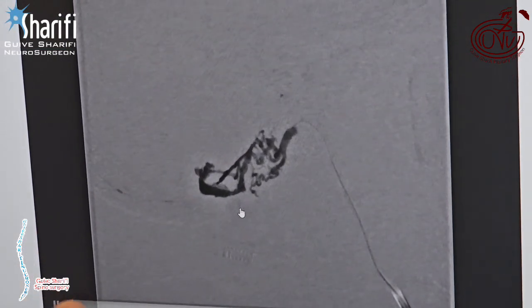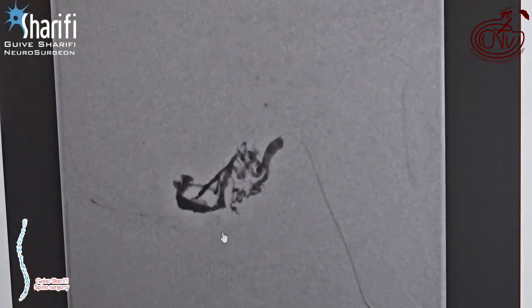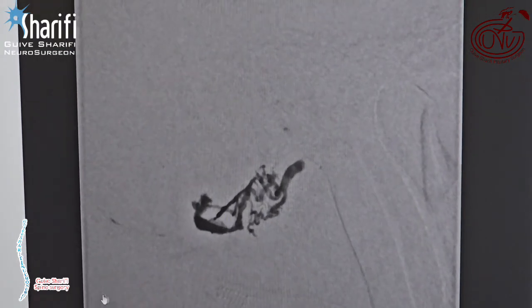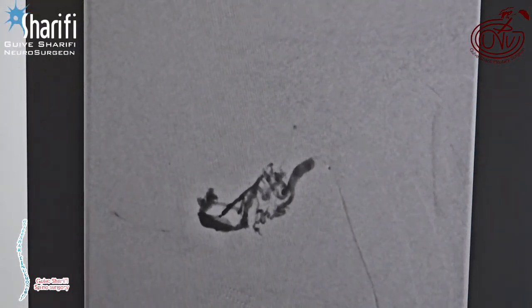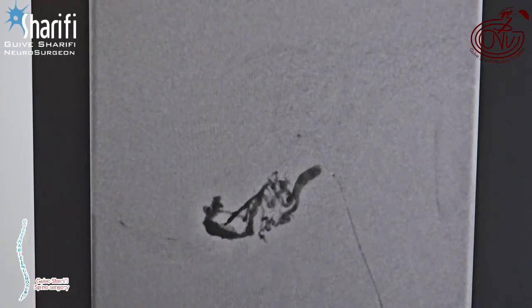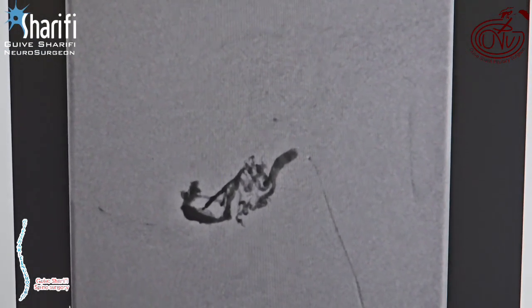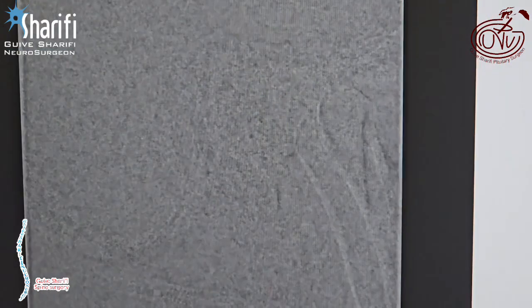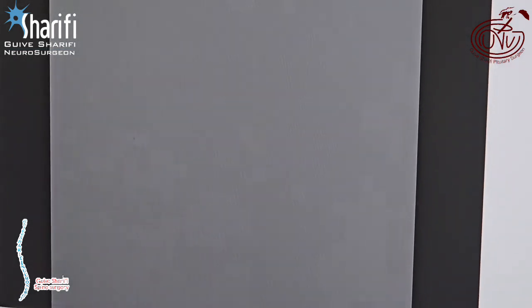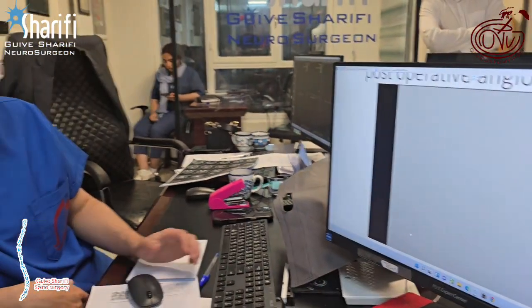You see the injection phase where Dr. Sohail injects the Onyx, and he was able to go as far as possible to reach the foot of the veins. The foot of the veins means the beginning of the venous part, and it is the most important location that should be covered by the injection of the embolic agent, as confirmed on the post-op angiography.